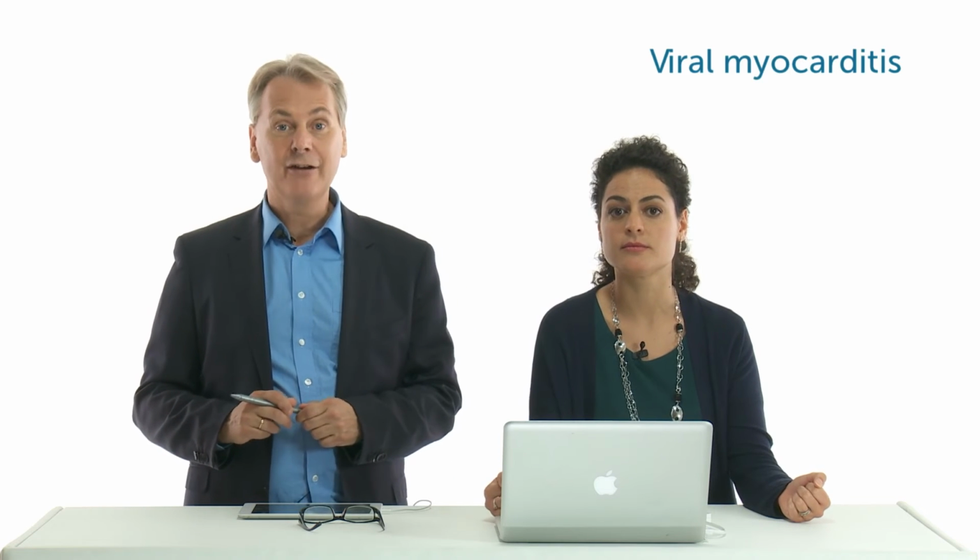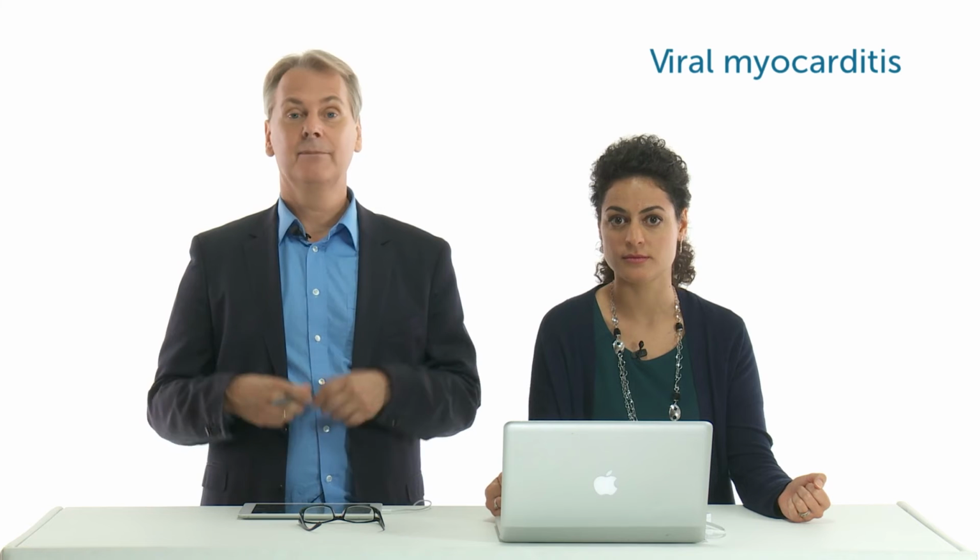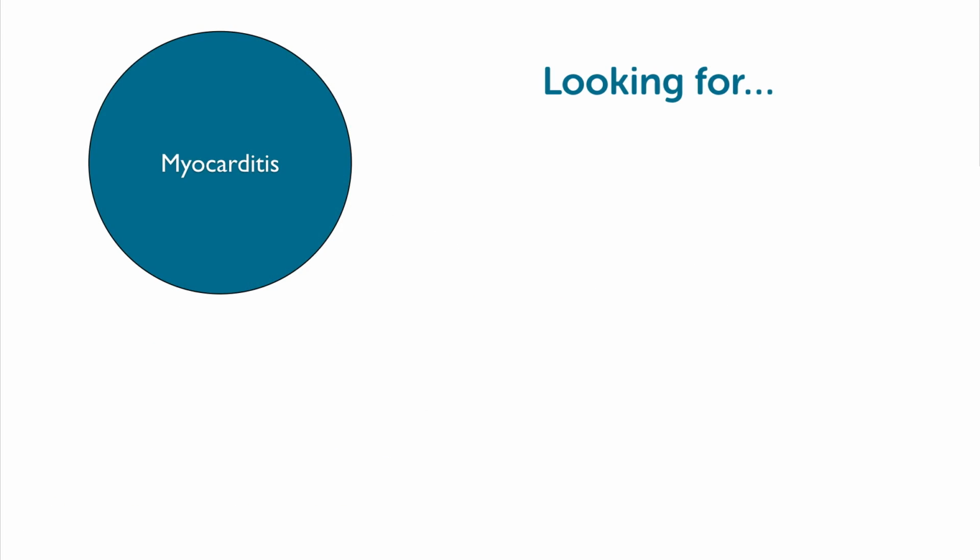Of course, we sent him immediately to the cath lab, but the coronaries were completely normal. We did establish the diagnosis of a viral myocarditis, and the patient fortunately recovered. Function was normal. He did not have any sequelae or problems. But the key message here is that, of course, myocarditis can sometimes look very similar to coronary artery disease or an acute myocardial infarction. So what should we be looking for on the echocardiogram?